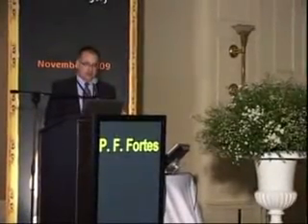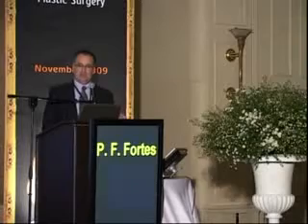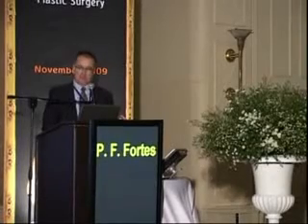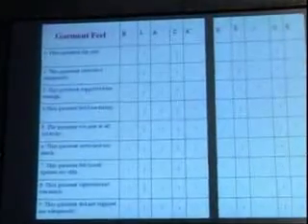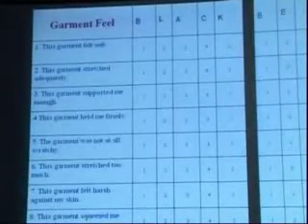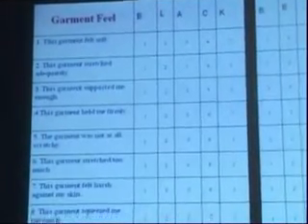The questionnaire consisted of making the judgment based on this rating scale of 1 to 5, where 1 meant that you strongly disagreed and 5 that you strongly agreed. And these are the 35 questions. And purposefully, the questions were made redundant so that we could make sure that patient answers were consistent. And these included such questions as, the garment felt soft, the garment stretched adequately, the garment supported me enough, and so on.